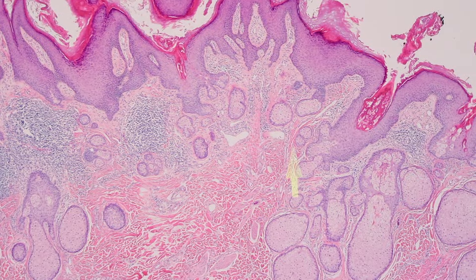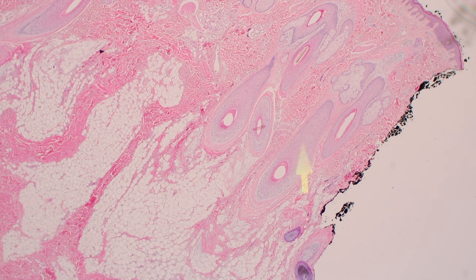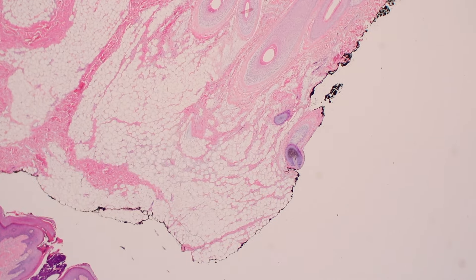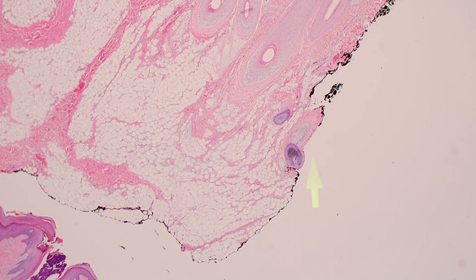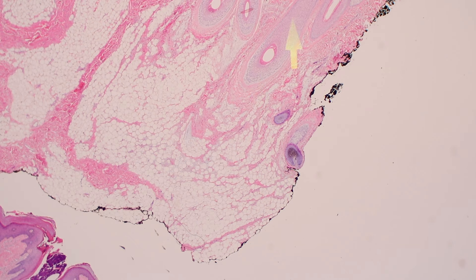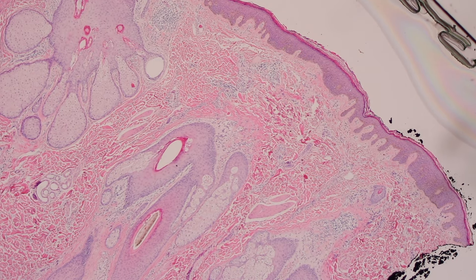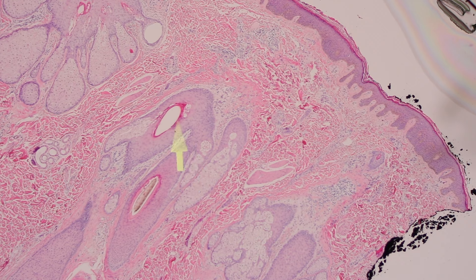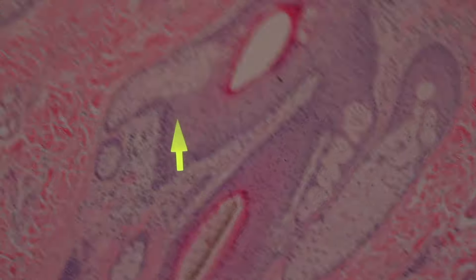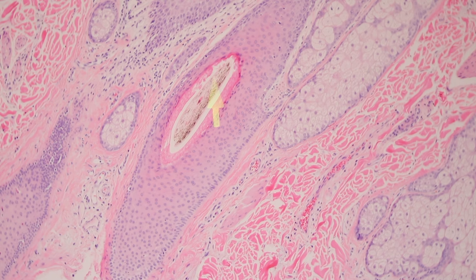These usually occur on the scalp, but what are we not seeing here? There's no hair. That's actually one of the most useful diagnostic features even from ultra-low power. Look at the normal scalp side — these are large anagen phase hair follicles that go way down to their roots in the subcutaneous fat. Here's a root cut at a funny angle. Remember, we're looking at a two-dimensional slice of three-dimensional skin. Here's a normal sebaceous gland draining into the hair follicle, and there's a hair shaft — that brown pigmented structure — in the middle of the follicle.